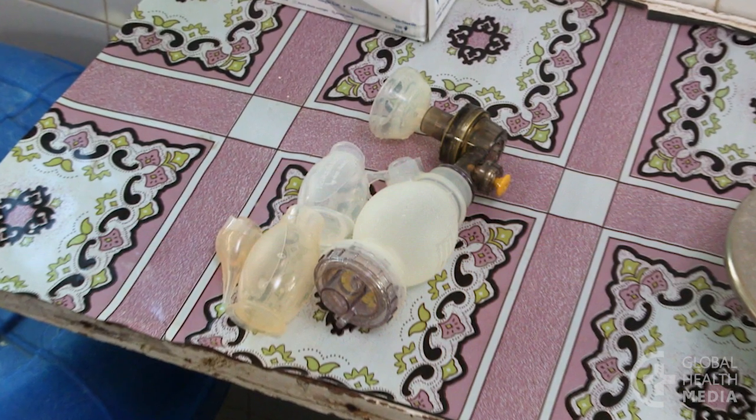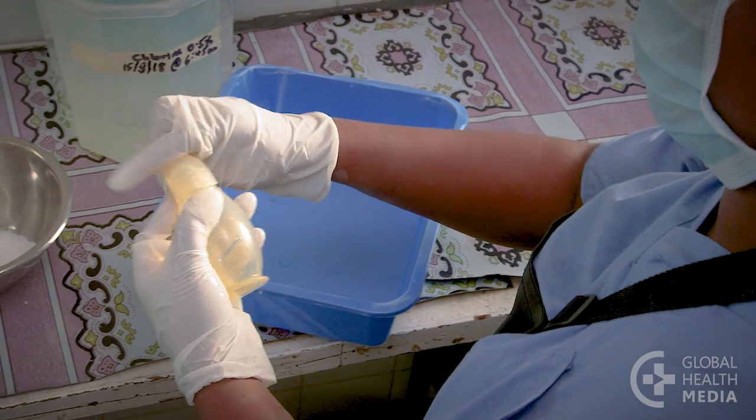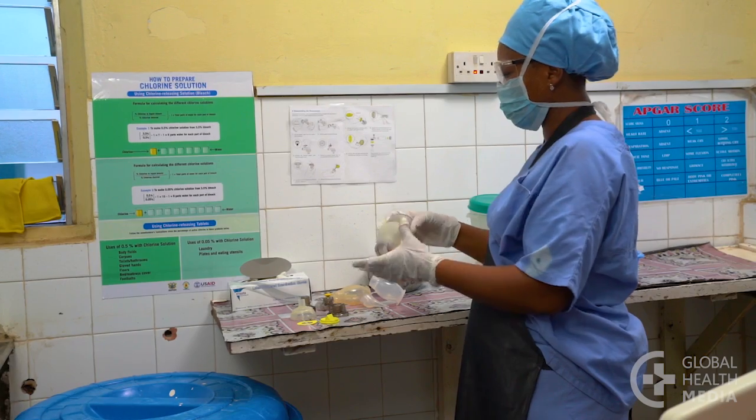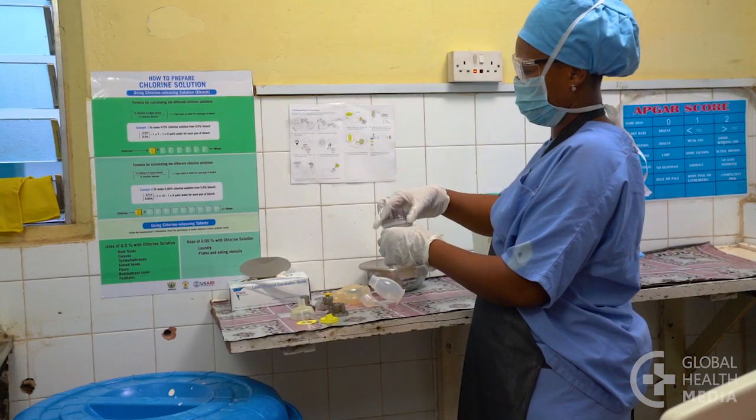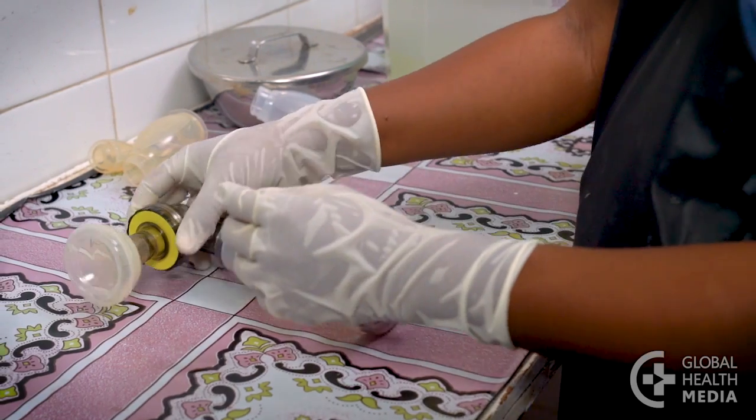Now, clean the equipment. Open the suction devices. Then take the ventilation bag apart completely. To help you remember how, take it apart in the same order each time.